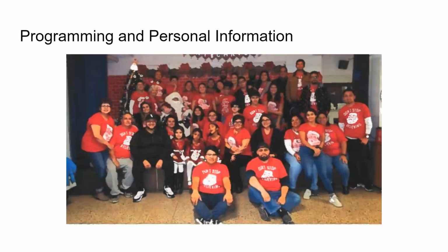Whether this is a device trial or your personal device, your team will be able to help you with getting started with programming. I would encourage you to keep a small notebook or a page where you write down what you might want to add to the device. This could include names of family, favorite places to go, favorite items of food that aren't in the device. Write it down. For the first round of programming, work with your SLP and team so things don't get confusing for your child. The key to the device is being strategic about organization.